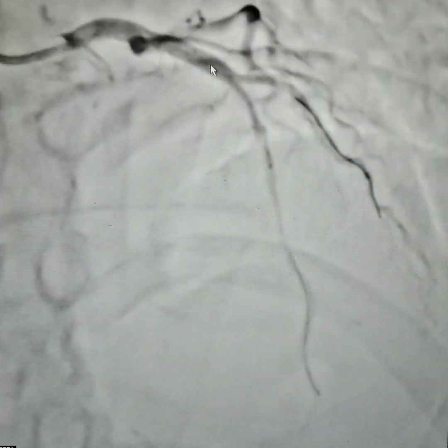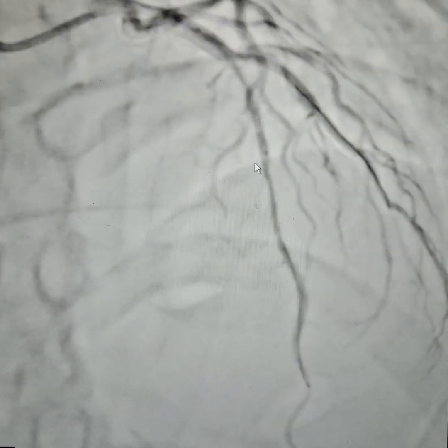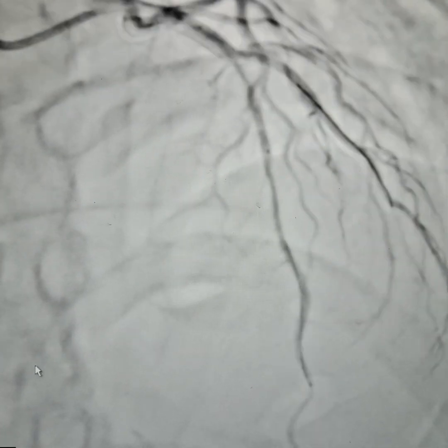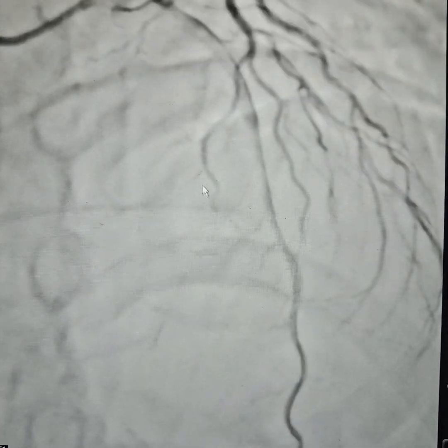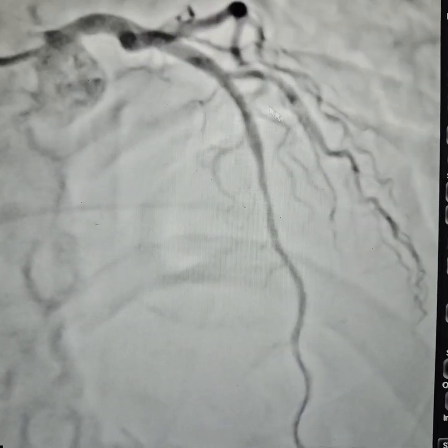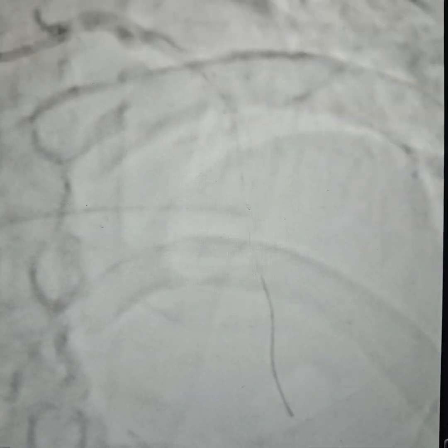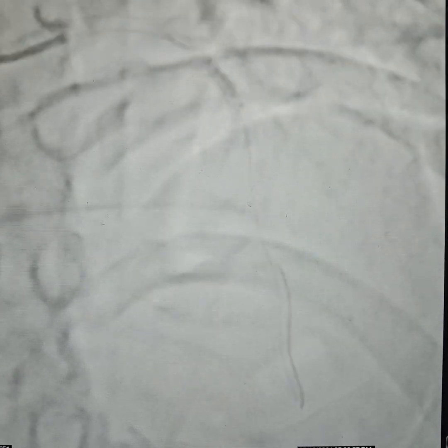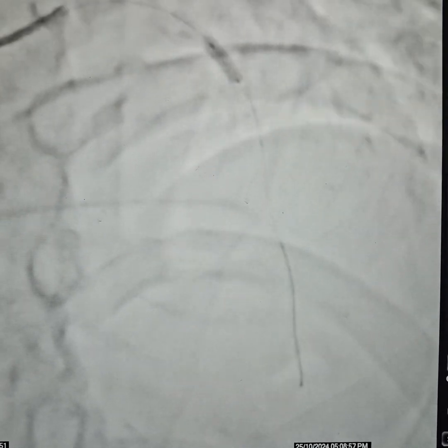We used a 3mm — specifically a 3x28mm stent. We inflated that stent at 10–12 atmospheric pressure. We then removed the jailed Whisper wire and gave some nitrates.